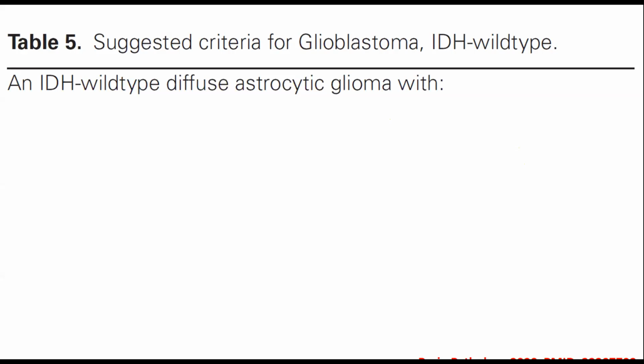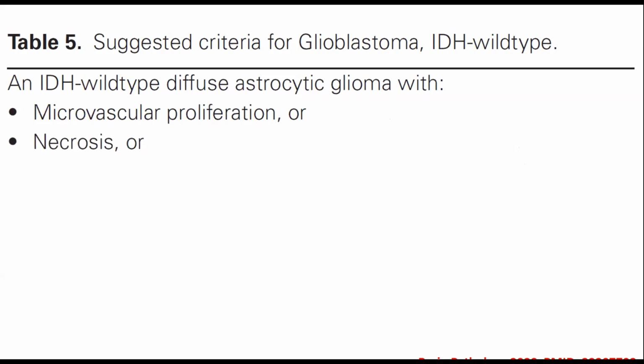In an adult, so IDH wild type diffuse astrocytic glioma, how are you going to know that? Well, our first indication is going to be the imaging, the T2 sequence, T2 and T2 FLAIR sequences, or any flavor. Let's say you don't have all that, maybe you just have a gradient echo, all right? Fine. IDH wild type diffuse astrocytic glioma in an adult with vascular proliferation or necrosis. That's WHO 2016. We already knew that, right? And usually it's going to correspond to robust, not wispy, faint, focal, but in your face enhancement.